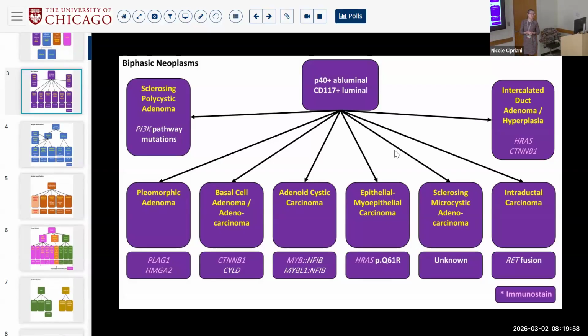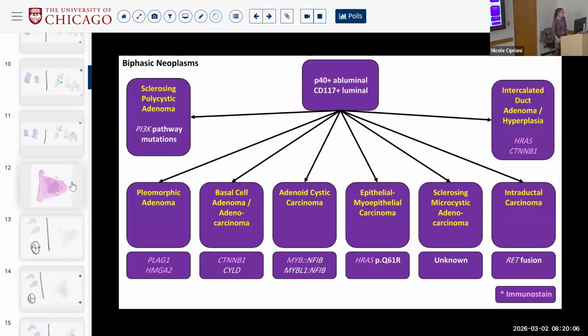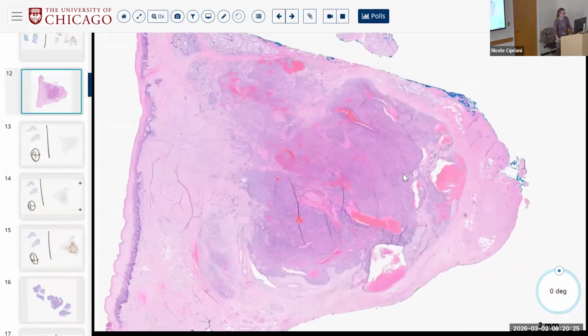Epimyoeps don't usually have these hyaline or these plasmacytoid myoepithelial cells. That's usually pretty good for pleomorphic adenoma. And with that being said, you can have duct or epithelial pore variations of PA, which this probably is, right? And you can have epithelial pore variations of epimyoep. However, those plasmacytoid myoepithelial cells are pretty characteristic of PA.